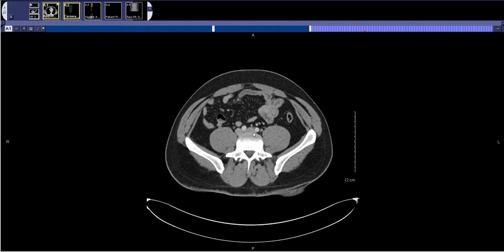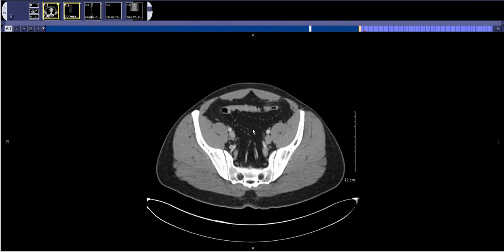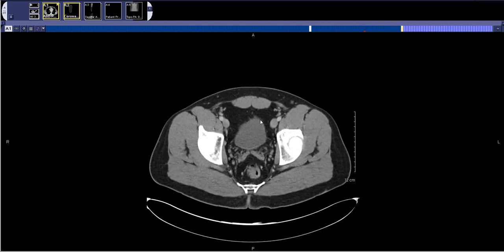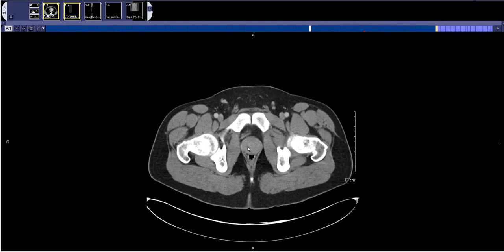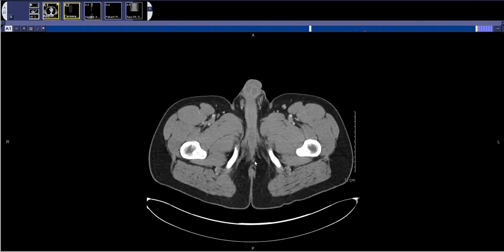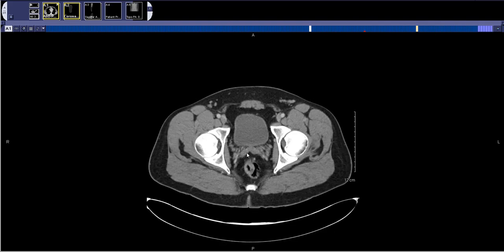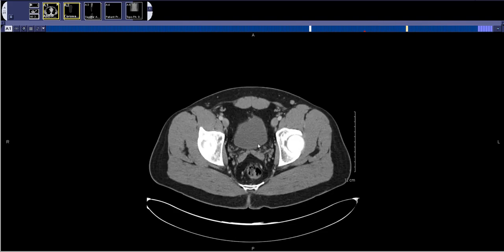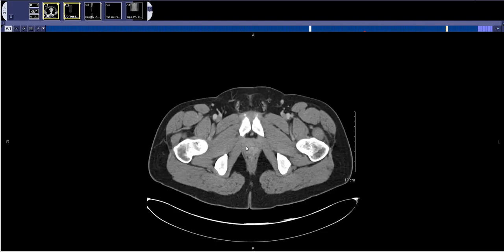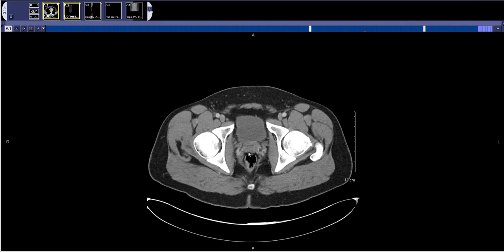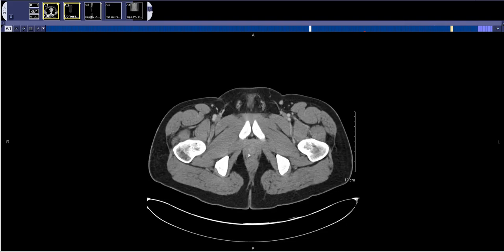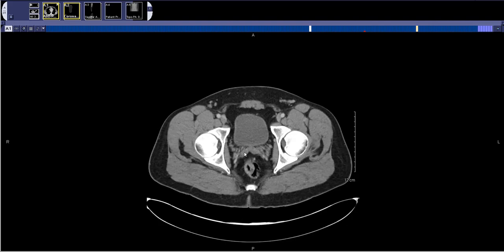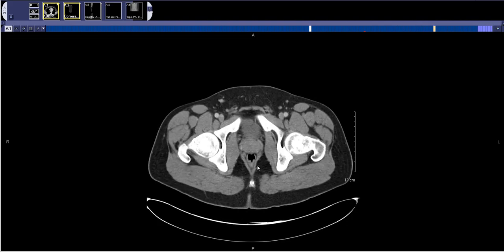At that point I switch down to the organs of the pelvis. This patient's a male, so we'll see the urinary bladder, the prostate, and the seminal vesicles. For the bladder you're looking for any wall thickening, mass, or stone. For the prostate, you're mostly seeing if it's normal in size, although you can also have prostate abscesses or cancer.